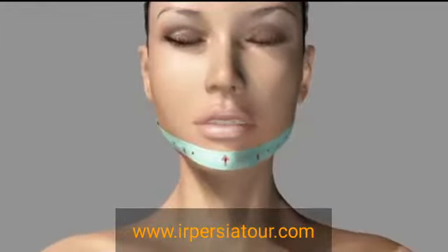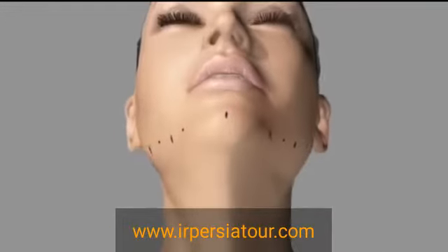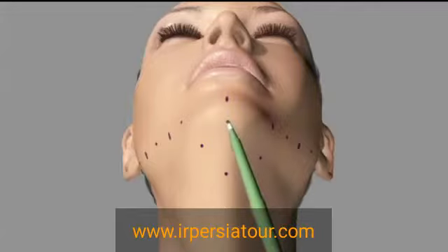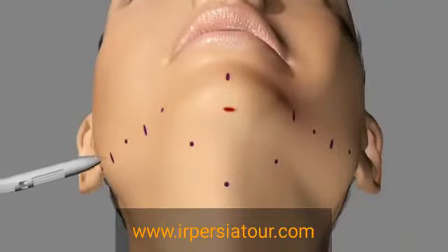Usually in a woman with a normal sized mandible, 3 pivot points are used on each side. In a male with a larger jaw, 4 to 5 on each side. The marks underneath the jawline indicate pivot points where the rod is able to pivot as it travels underneath the jawline over the curved surface. These random dots allow the rod to pivot as it passes underneath the jawline.